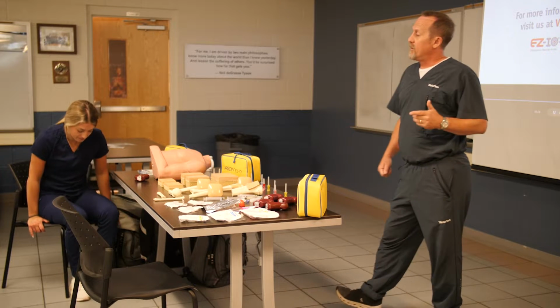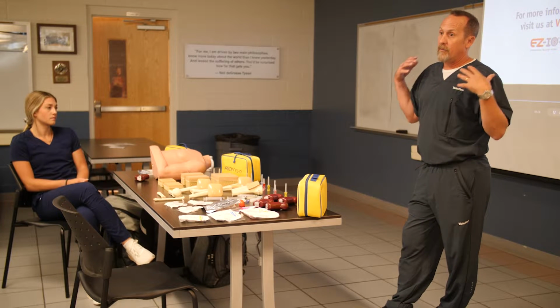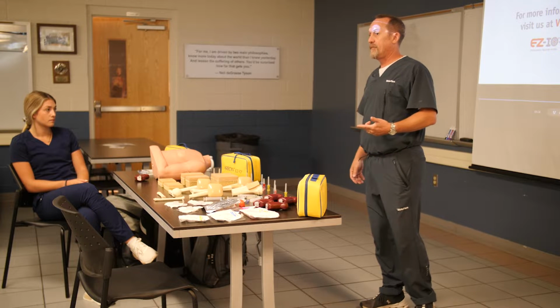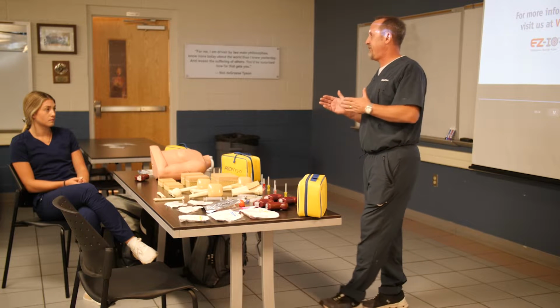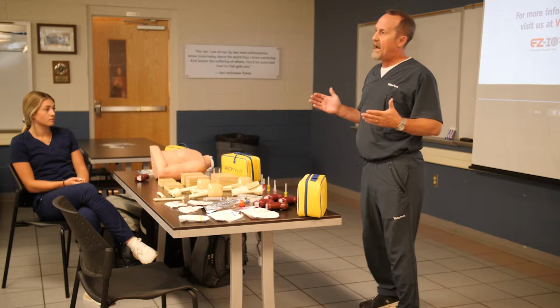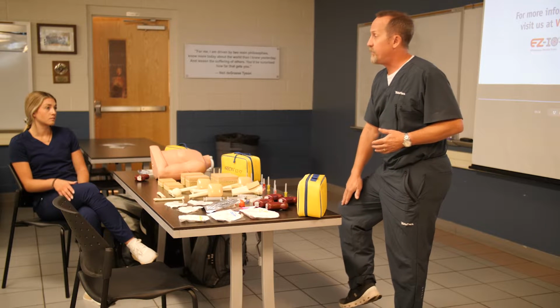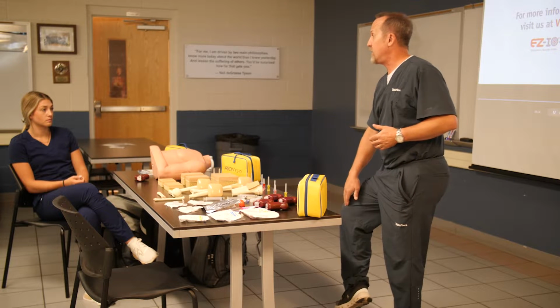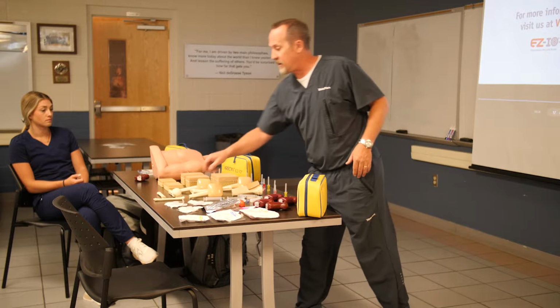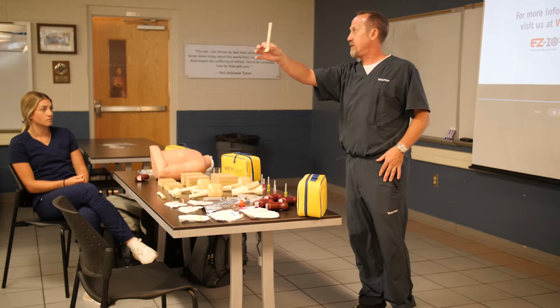The only other thing I want to talk about as far as areas on the body we can go into on a pediatric patient, and we typically would say 15 or younger, though IO 21 and younger is pediatric, is the distal femur, and I'm going to talk about landmarking that here in a minute as well. The distal femur is a great spot when you think about most of your pediatric patients. This is a tib fib of a pediatric.